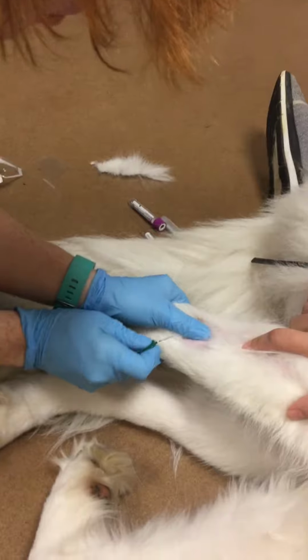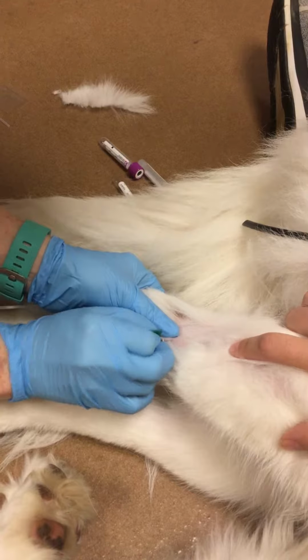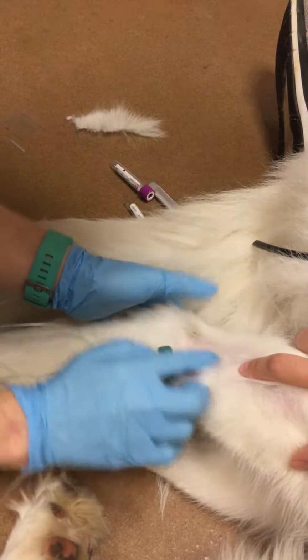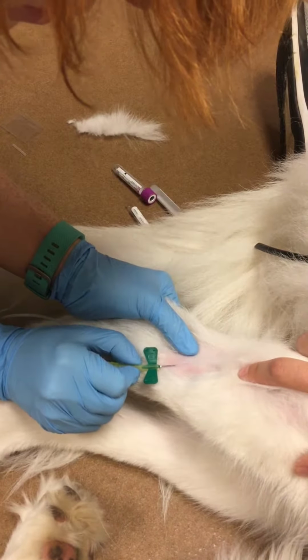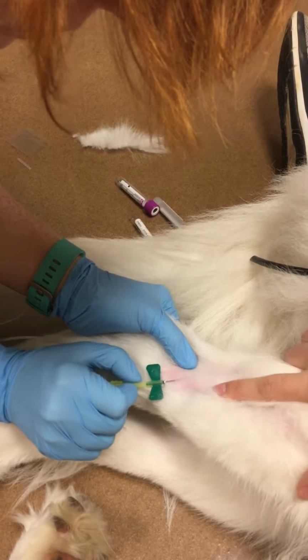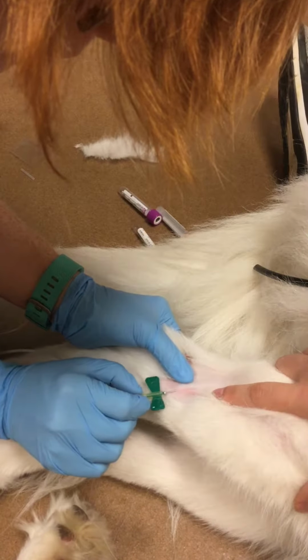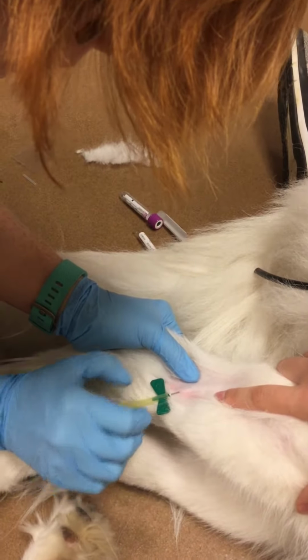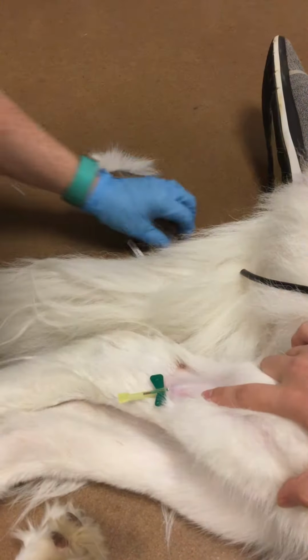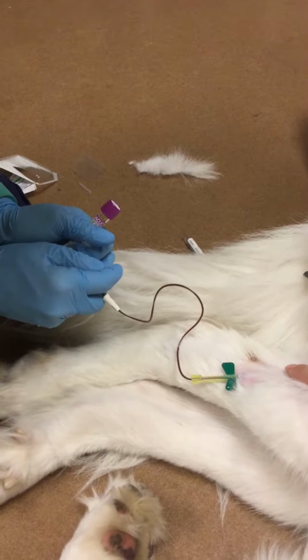And I'm going to, it's a little rolling. There we go. And we're going to fill the tubes up.